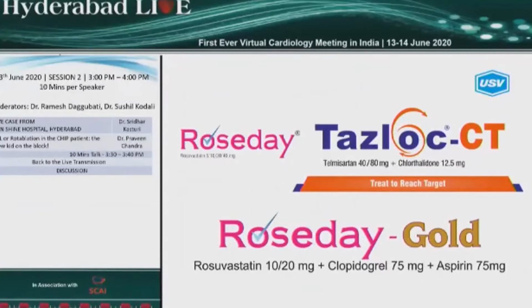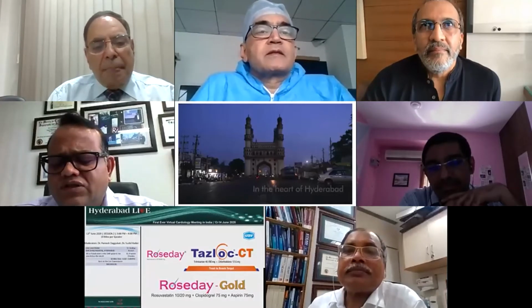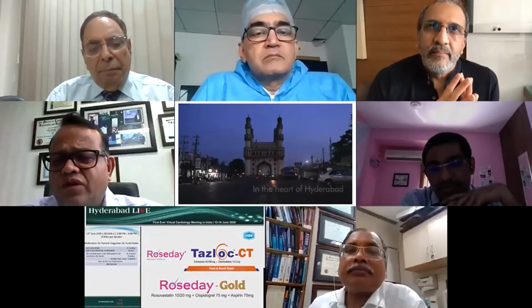I think Dr. Vijay Kumar Suban, just one moment, sir. Vijay, do you have any comment with your so much experience of IVUS? I do prefer to go ahead with IVUS for most of my left main bifurcation lesions. Sometimes I have also used OCT, but I'm more comfortable with IVUS. FFR does help for assessment of the left circumflex ostial significance after putting a left main to LAD stent. But practically speaking, I prefer to go ahead with imaging of the ostial LCX as well after putting the stent, to see how much is the area, and then decide about ostial LCX intervention.